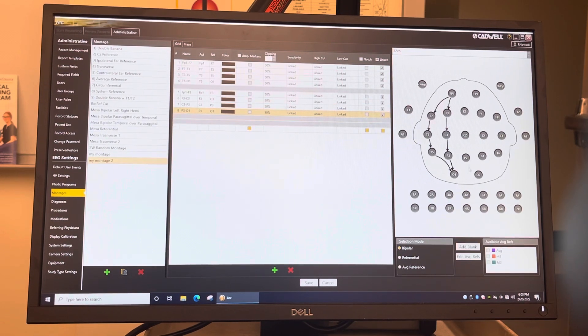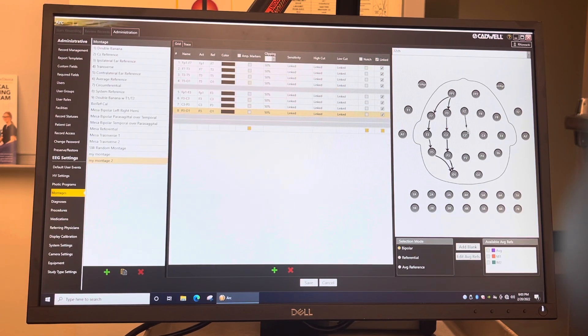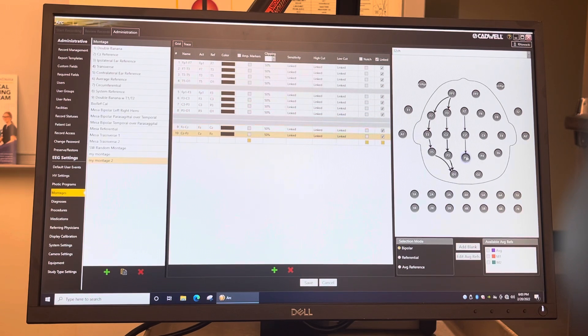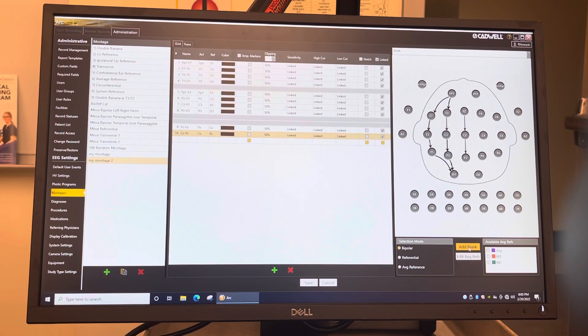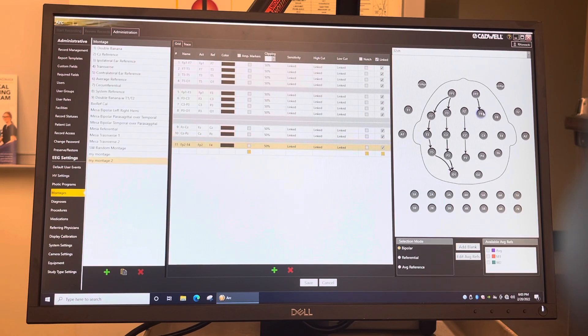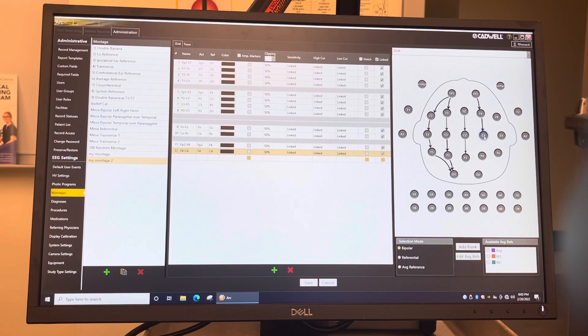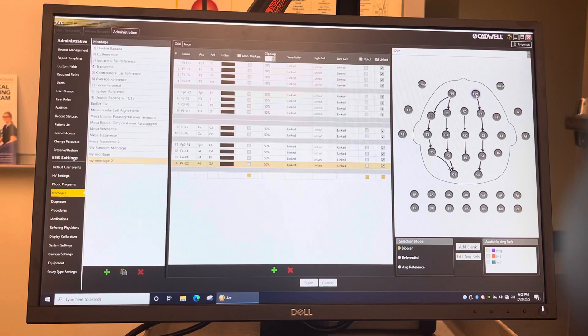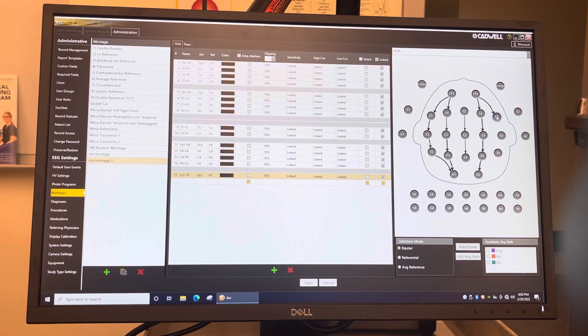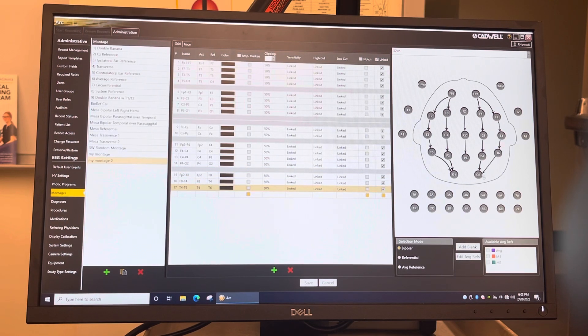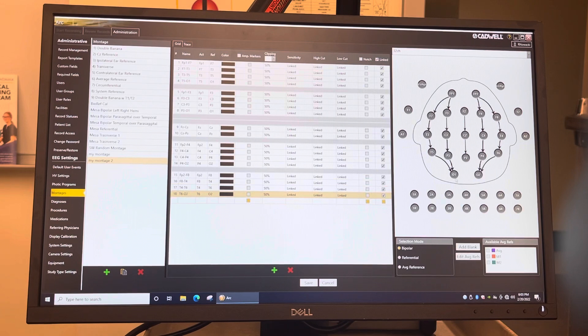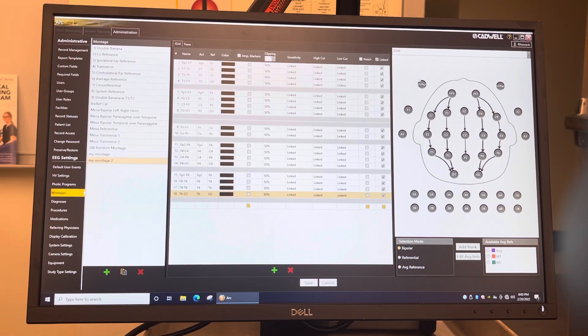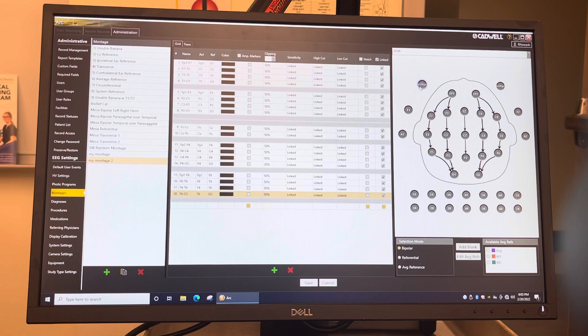So we're going to add a blank and then I'm going to go right down the midline to separate my hemispheres. And I'm going to add a blank, and I'm going to go right parasagittal. Add a blank. I'm going to add another blank.